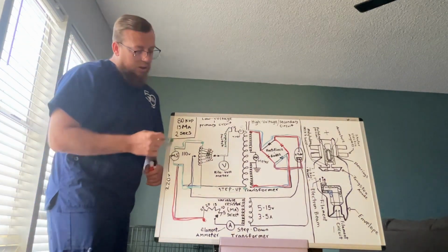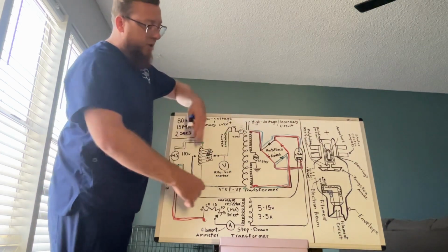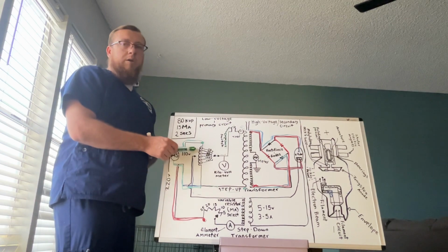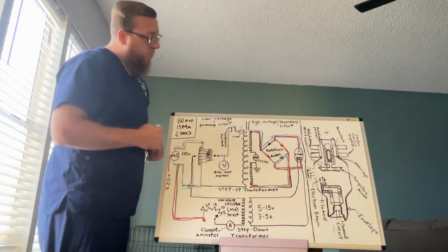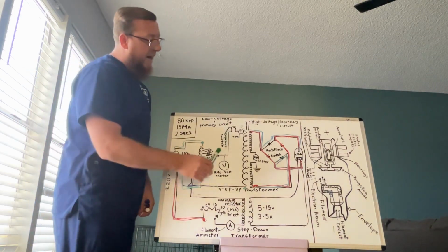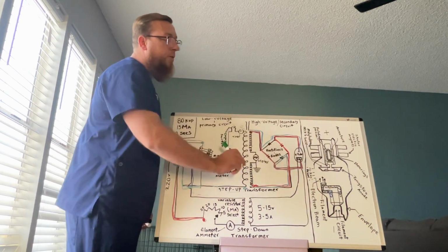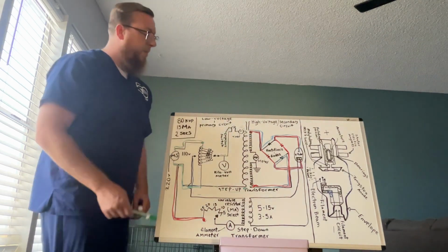So once we have all of our control panels set, all this is flowing at 110 volts. This is our first auto transformer that we're going to be dealing with. Once I hit this exposure switch, it's going to allow electricity to flow through the rest of the circuit for the approximate time that I set on my control panel.